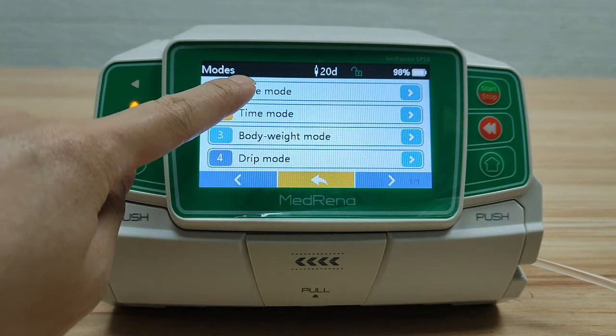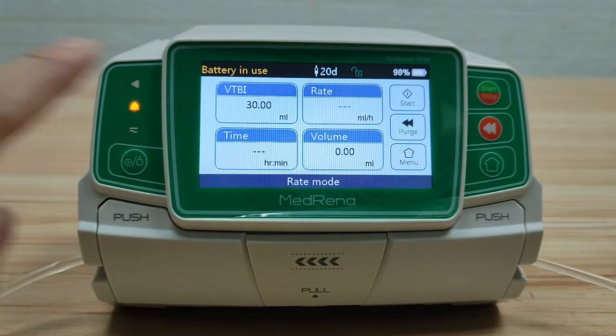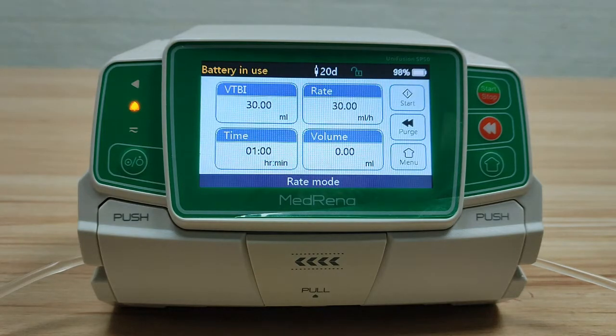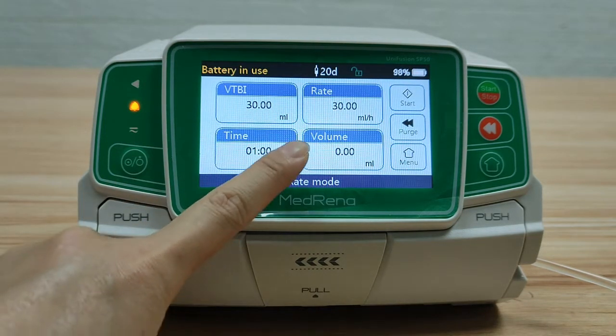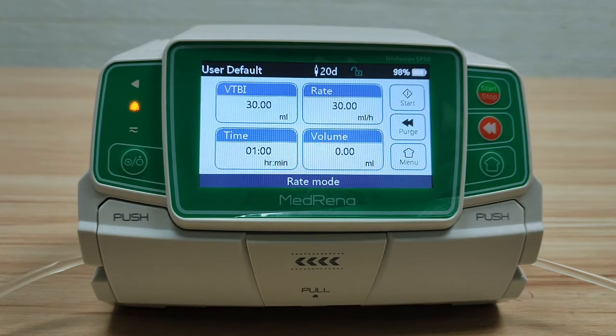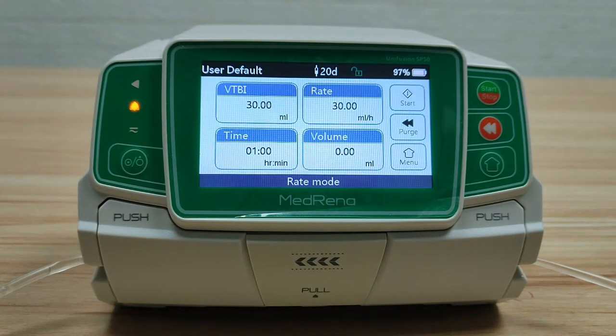The first mode is Rate Mode. In this mode, we set the volume to be infused and the flow rate. The flow rate range is from 0.1 mL/hr to 1500 mL/hr with an increment of 0.01 mL/hr. Here we enter a rate of 30. The pump automatically calculates the infusion time needed. Before pressing the start button, always remember to purge first. Purging applies a large flow rate to quickly remove air bubbles from the infusion line, ensuring air won't be infused into the patient's body. After confirming no air in the extension line, stop the purge and start infusion.